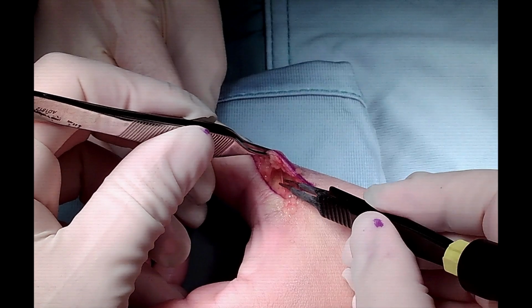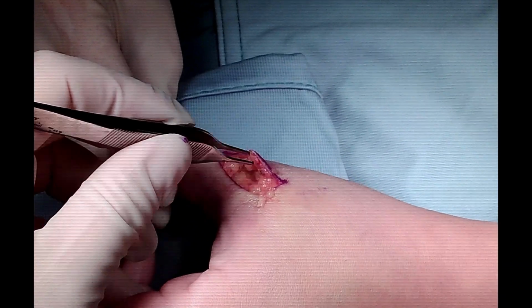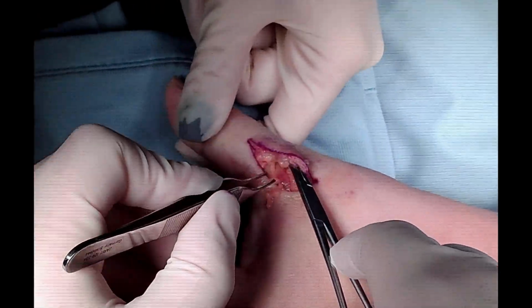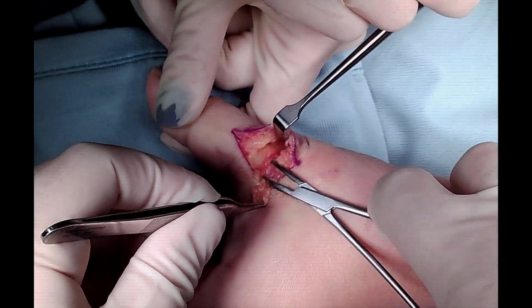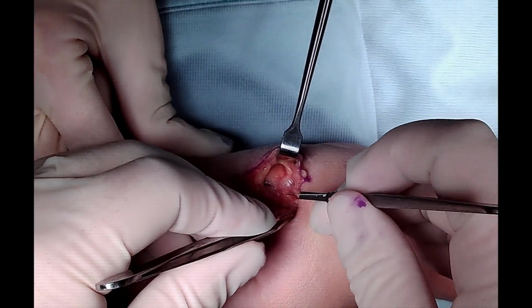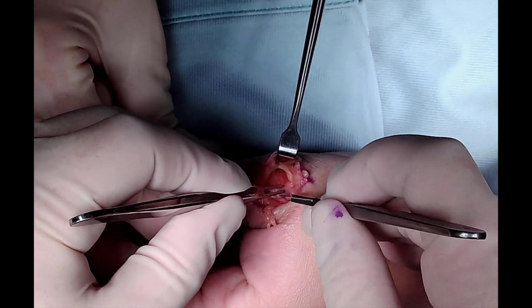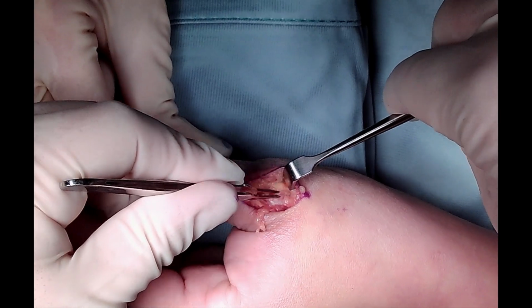Following this, we expose the adductor aponeurosis that is continuous with the extensor mechanism. At this stage, we cauterize any crossing vessels that may impede our dissection. As we can see here, this is the nerve that has been recognized and kept safe with a retractor. Now we can see the adductor aponeurosis and we open it.